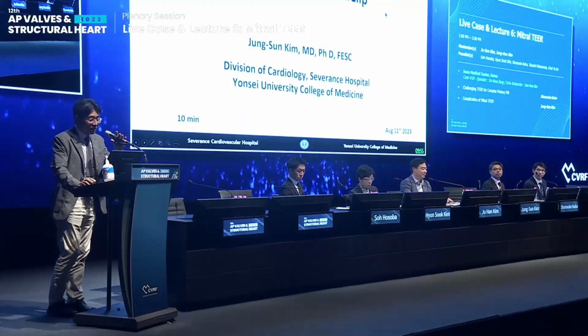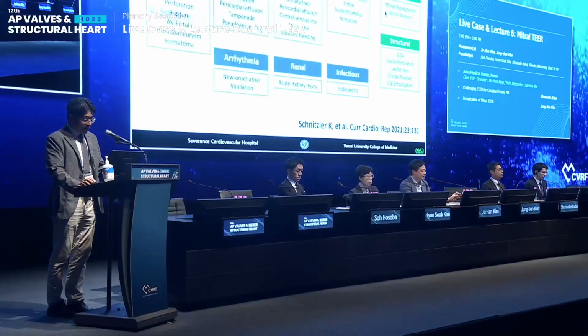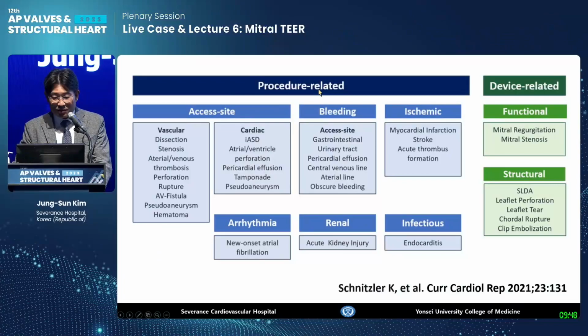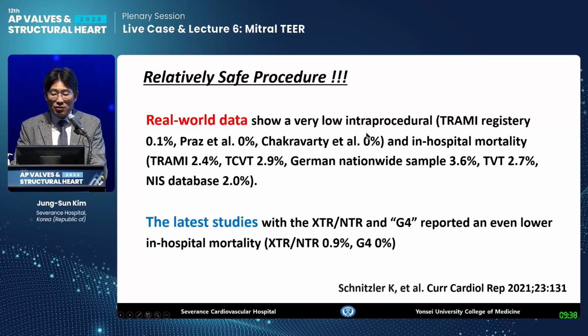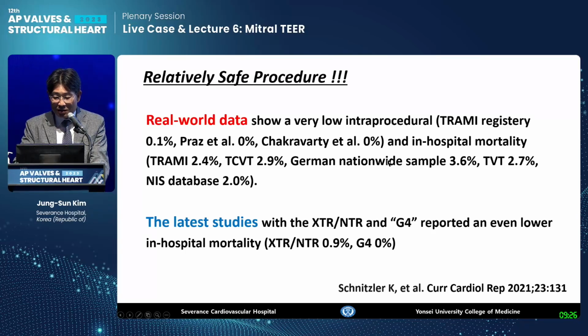Yeah, thanks for the introduction. As you know, there are several possible complications, some of them procedure related, some device related. But the TEER procedure is a relatively safe procedure. Real world data shows a very low intraprocedural mortality, 0.1 or 0%, and hospital mortality is 2.4 and 3.6%. But the latest study with recent advanced technology reported even lower in-hospital mortality, around 0.9 and 0%.